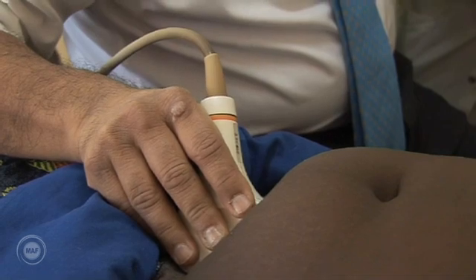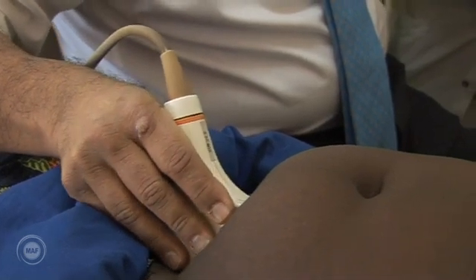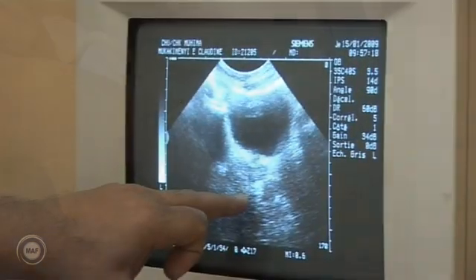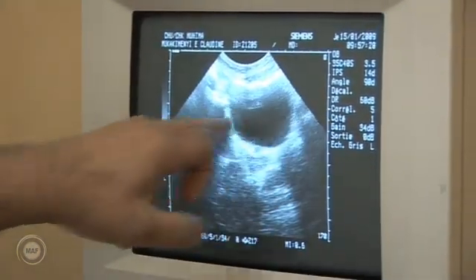In summary, before proceeding with the finer points of diagnosis using ultrasound, it is important to clearly understand the orientation of the fetus and its organs within the uterus and to accurately learn the language of its description.